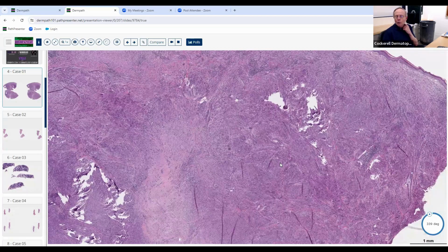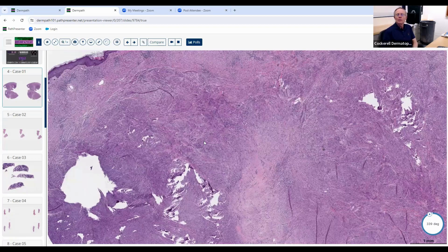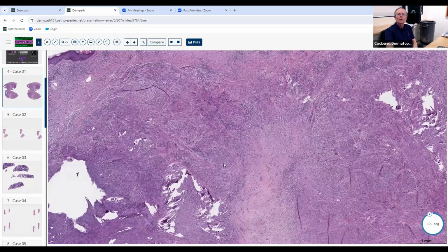So, dermatopathology for dermatology residents, kind of KISS, keep it simple, stupid. You don't want to get into super esoteric things. The boards are not going to expect you to know all the bizarre soft tissue tumors and all that sort of thing. They want you to be able to define the 3 to 4 most common spindle cell lesions. We've talked about this many times, but mainly muscle, fibrohistiocytic, and neural. Those are the three main ones that you're going to look for. And there's really not a gazillion differential diagnoses that you need to have when you're determining those three.